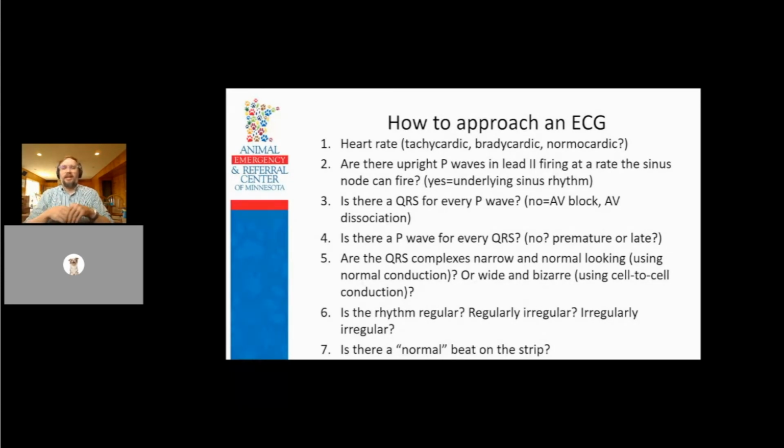And I think it starts to get confusing when you start doing regularly irregular or irregularly regular. I don't know, it gets confusing. I think people think they mean different things. So the way I think about it, is it regular or is it not? And if it's not, does there seem to be a pattern? I know that's what it's trying to get to, but I feel like it always gets confusing.